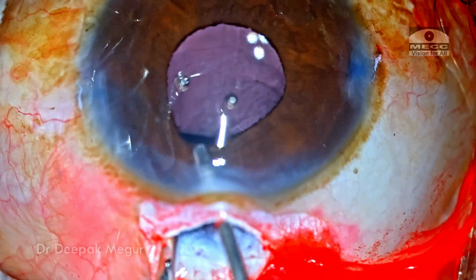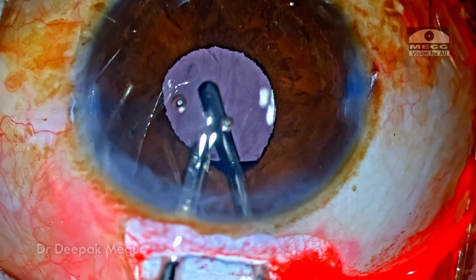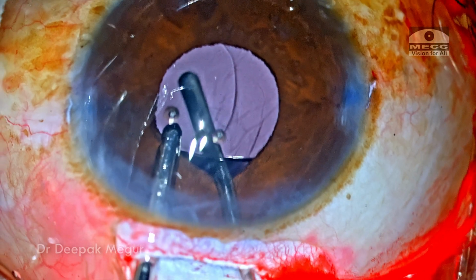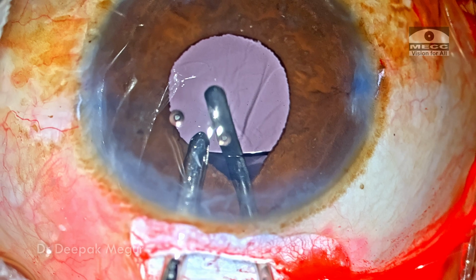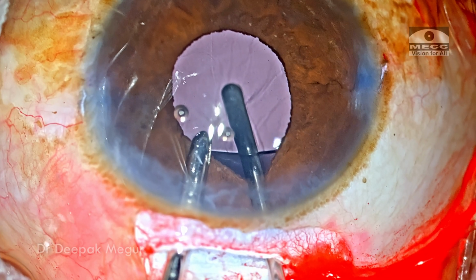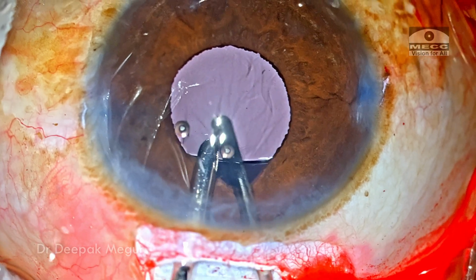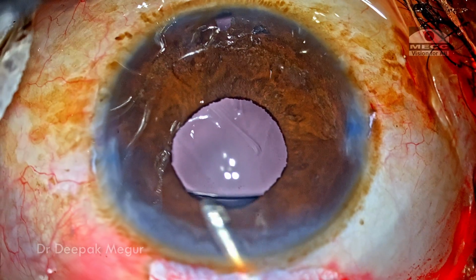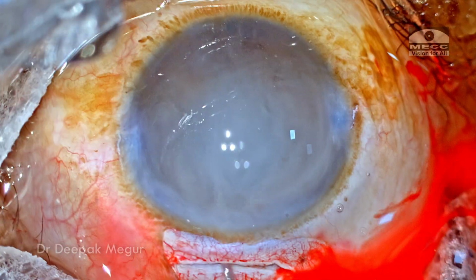I'm going to use the vitrector to remove the OVD which is behind the lens. When the eyeball is soft, going through the side port becomes a little bit tricky. I'm going to use the cutter through the main port itself. It is introduced under the lens, and the OVD which is pumped below into the vitreous cavity is just cut and aspirated out. So this was a case about using an iris clip lens in a patient with Microspherophakia.